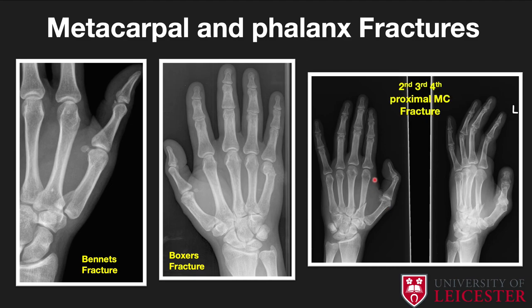Fractures of the second, third, and fourth metacarpal bases can also occur together. Here you can see a significant oblique fracture of the second metacarpal, with associated fractures at the bases of the third and fourth metacarpals. The lateral oblique view demonstrates the considerable angulation and displacement present.